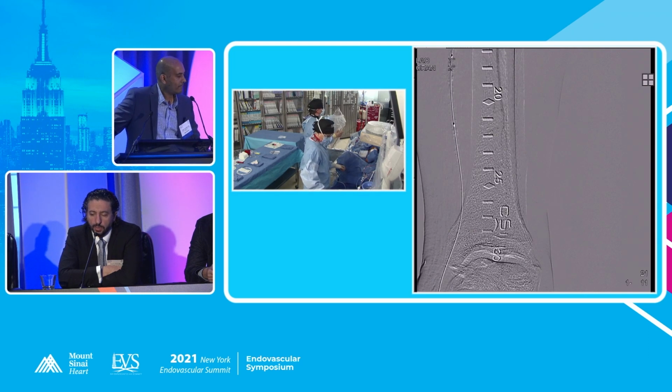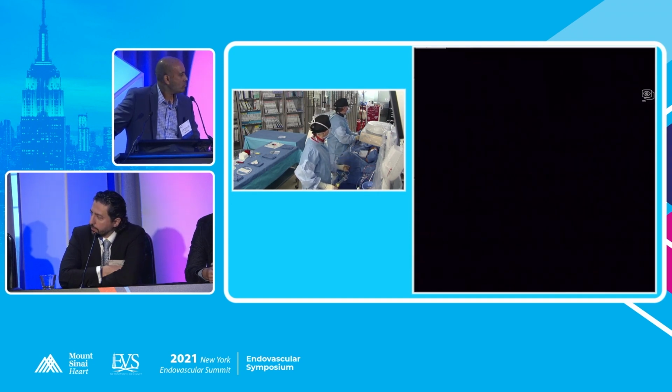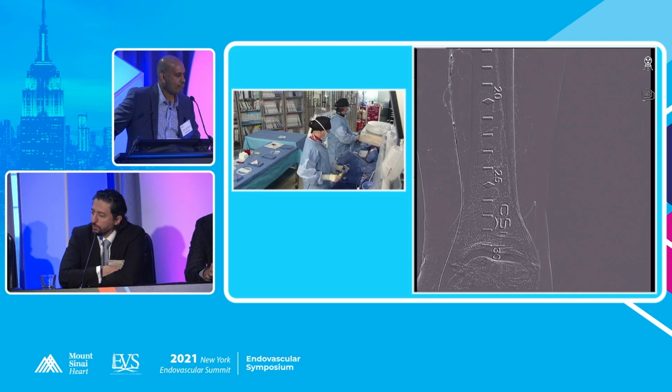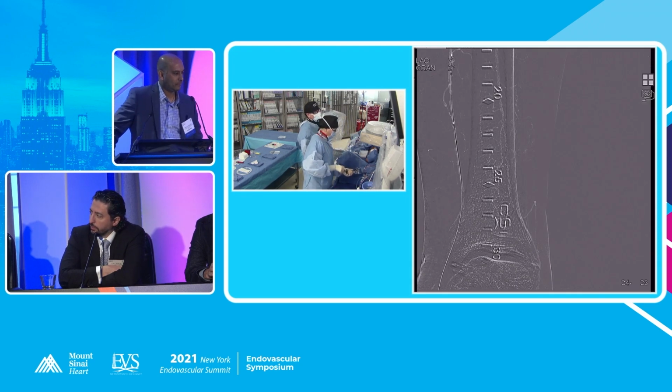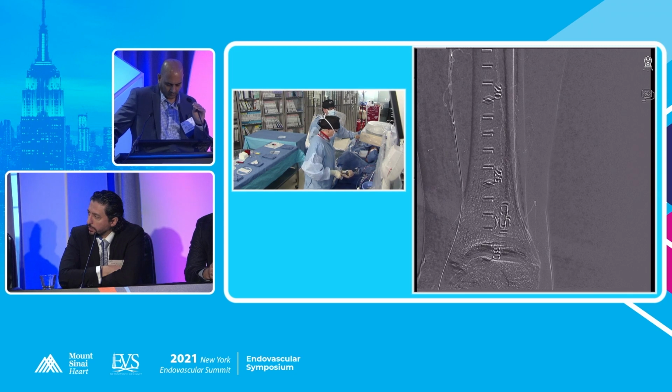But something that might be a little bit unusual here, since you have a patient on the table, if you have a multidisciplinary team, consider treating the outflow and then talk to your surgical colleague, because even if you do an endarterectomy, you're not going to access that right away to do an endovascular approach to treating the PT. So that's something that we've done in the past. We talked to our surgical colleague and treated the outflow and then sent the patient for endarterectomy. It's not ideal, but it would work in the patient's favor.